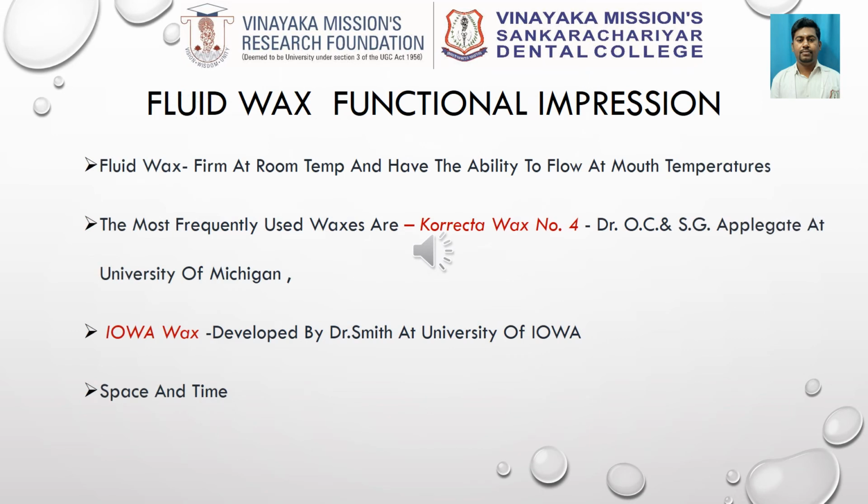As you know, the fluid wax impression is used to make a reline impression for an existing partial denture or to correct the edentulous ridge portion of a master cast. So what are the objectives of the fluid wax functional impression? First, to obtain the maximum extension of the peripheral borders while not interfering with the function of movable border tissues. And second, to record the stress-bearing areas of the ridge in their functional form and to record the non-stress-bearing areas in their anatomic form.